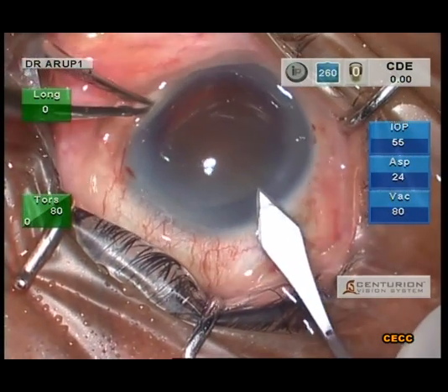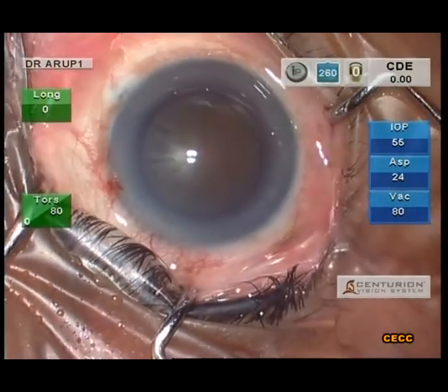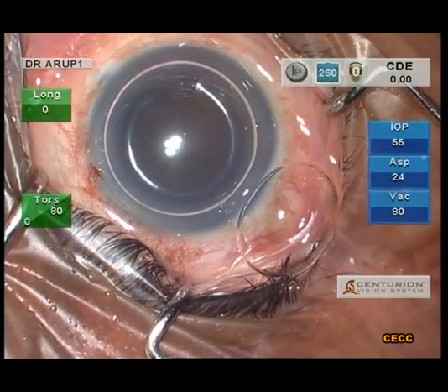I never forget to stain the anterior capsule with trypan blue in these sort of cases. A soft shell strategy is employed for endothelial protection.